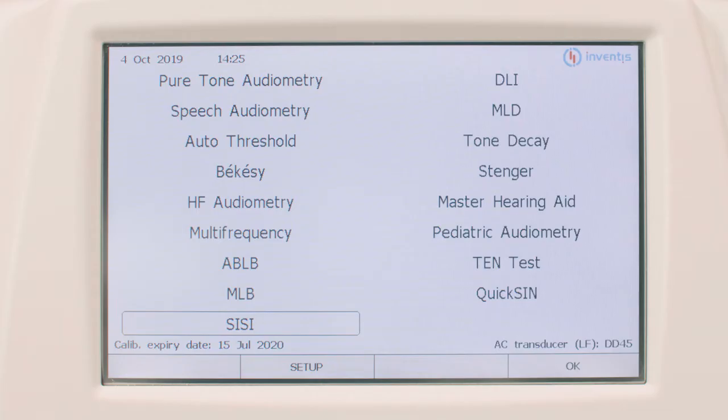In this section we will talk about how to perform supraliminal tests within Ventus Piano. Exams conducted above the hearing threshold allow audiologists to identify the level of hearing damage in better detail and to differentiate between cochlear and retrocochlear disorders. In this video we will have a look at how simple it is to carry out these tests, focusing on the TEN test, the SI-SI test, and the Stenger test.